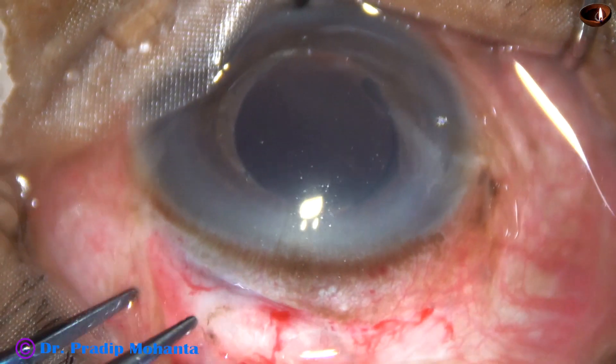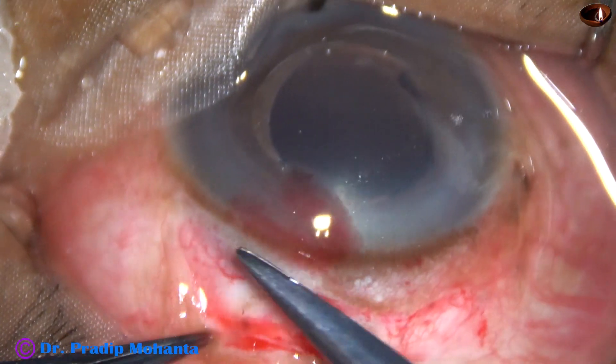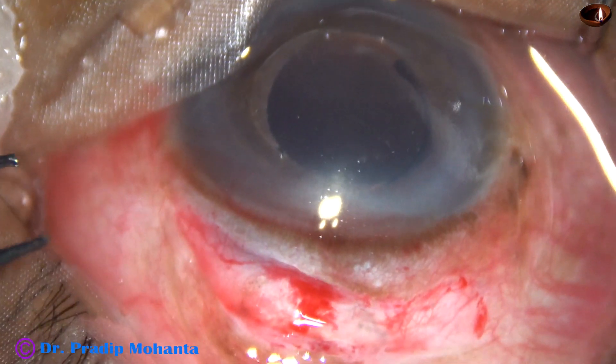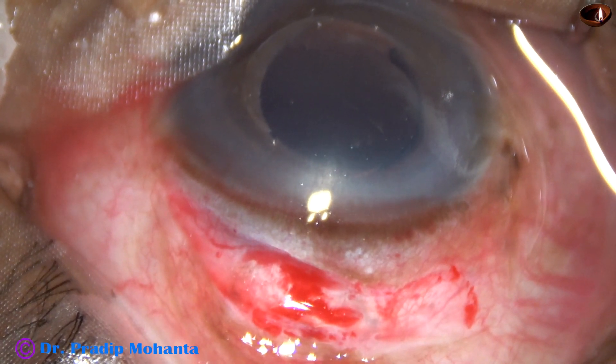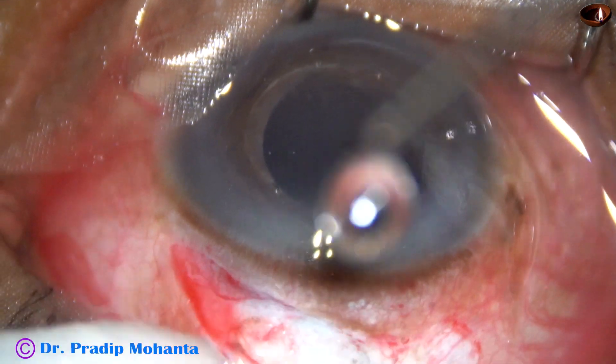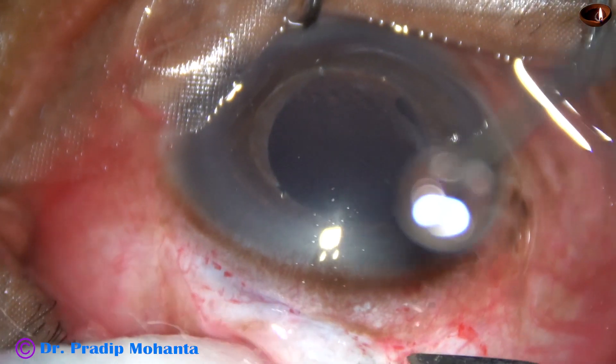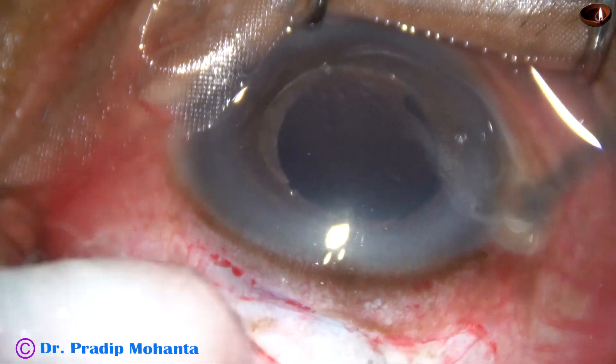I have started this surgery after superior rectus bridal suture. Conjunctival peritomy has been done. There are some adhesions. SICS was done previously. After the peritomy, this is wet-field cautery for hemostasis to get a clean area for incision.